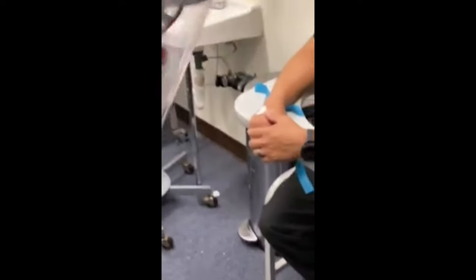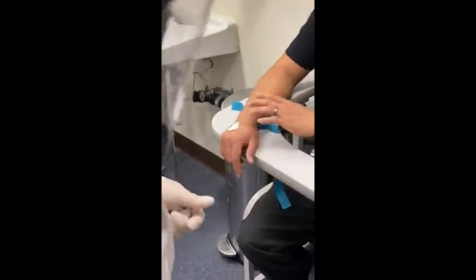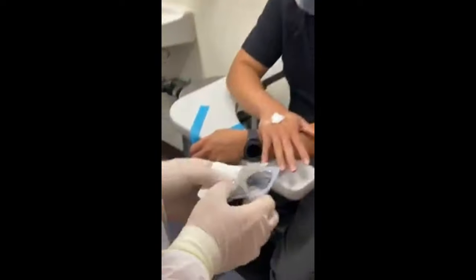Perfect. And after that, that's good to go. Can we just continue to apply pressure? Okay, perfect. Put the tape right here. Okay, good. So I just want to say thank you very much for your cooperation, I'll just start the cleanup and everything. Yes, okay, perfect. Then you can release the patient, and then you clean up the area.